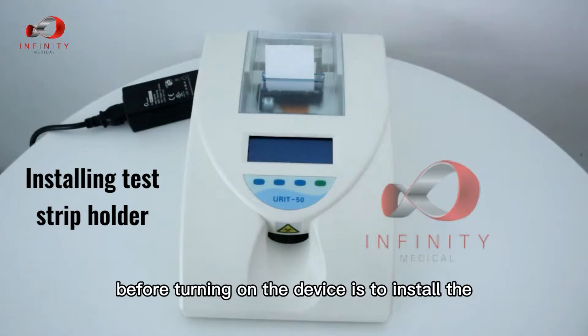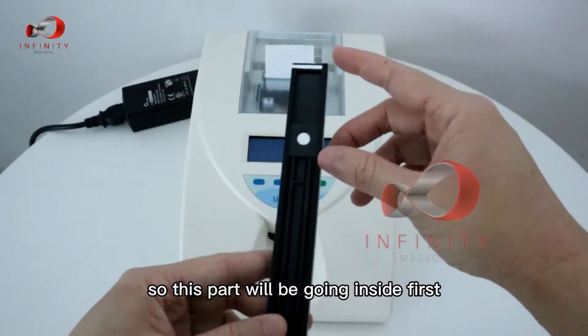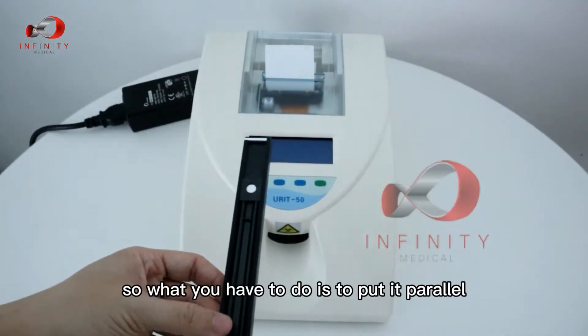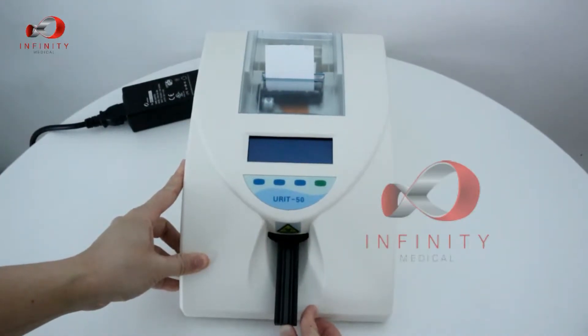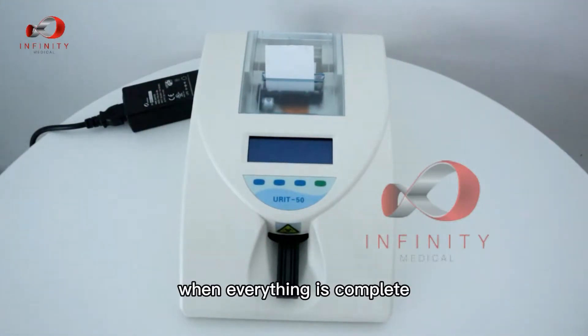The next step before turning on the device is to install the reagent strip holder. Insert the inner part first, then the outer part — align it along the track and push it in. When everything is complete, you can turn on the device.